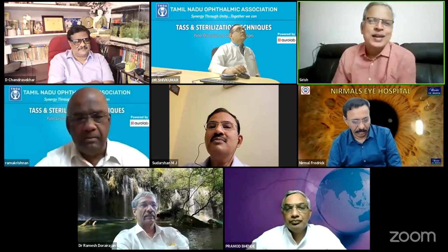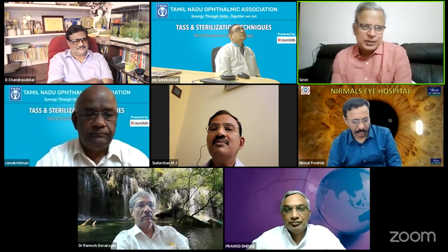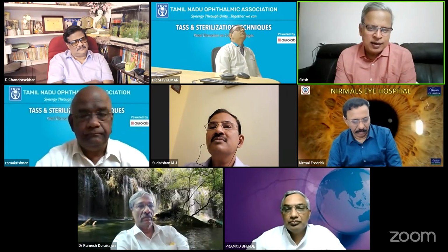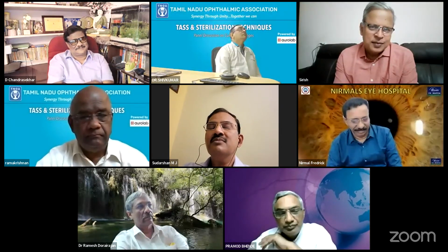I would like to ask one specific question to Mr. Krishna Kumar. Thank you for enlightening us on this process so well. Is there some solution in which, if we dip the IOL, all monomers will be washed away, and after that it is perfect to use? Sir, monomers will not go away, but endotoxin will go away, sir.